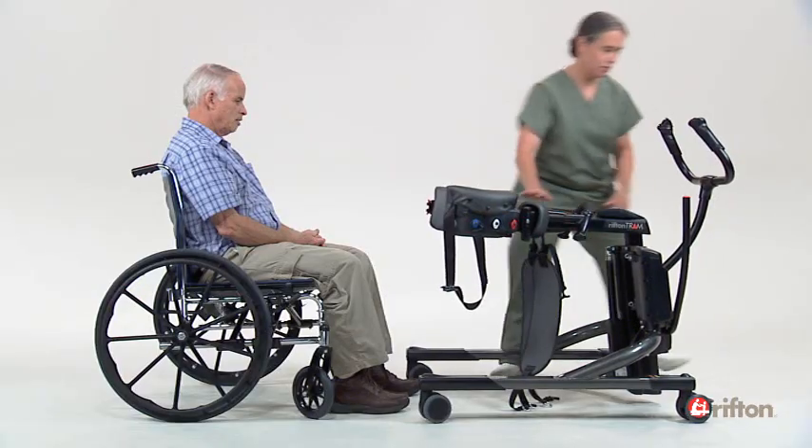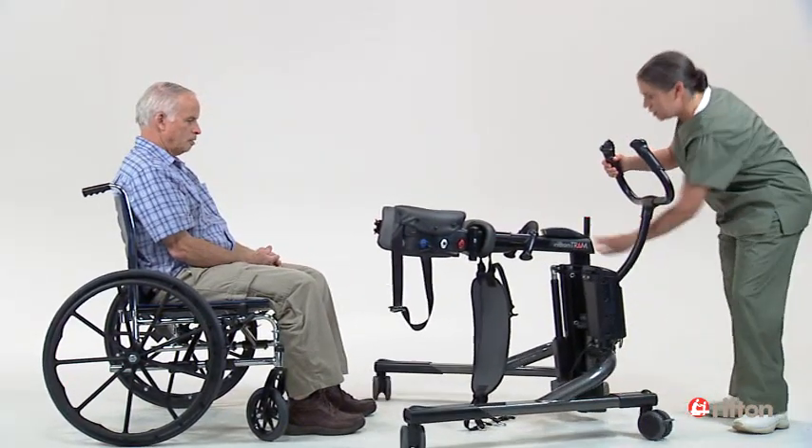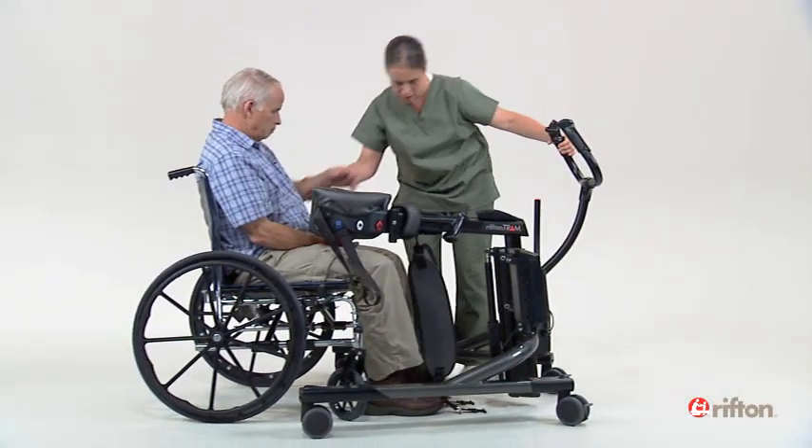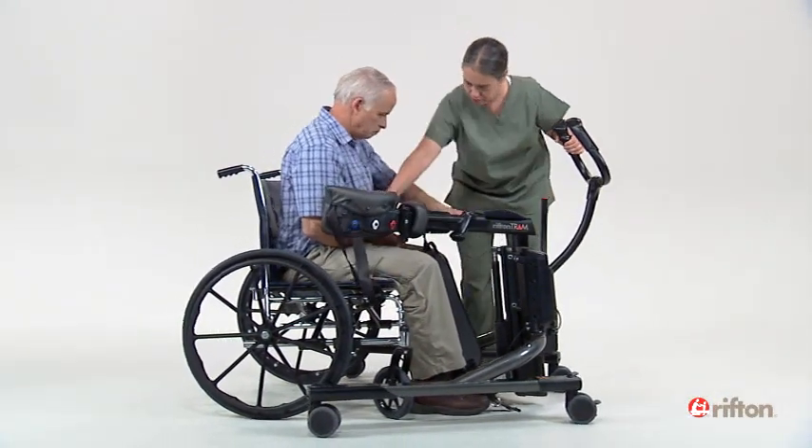If possible, remove the armrests from the wheelchair for easier access. As you approach your client, explain reassuringly what you will be doing. Having your client relax is so important for your first lift to go well.